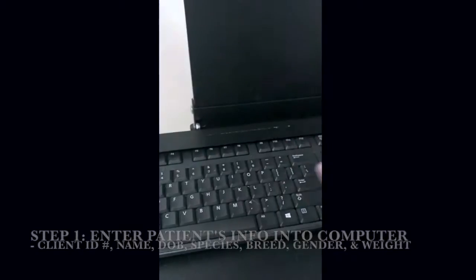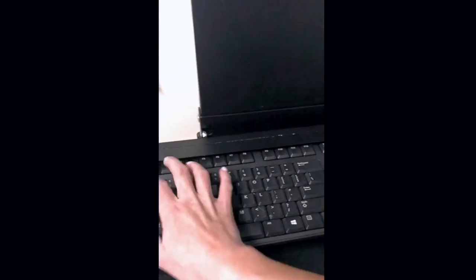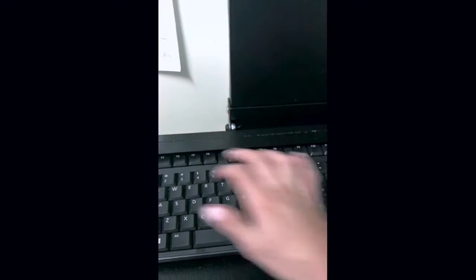We always start by entering the patient info into our X-ray computer database. We just use Antech Imaging Services, which is really easy and straightforward.